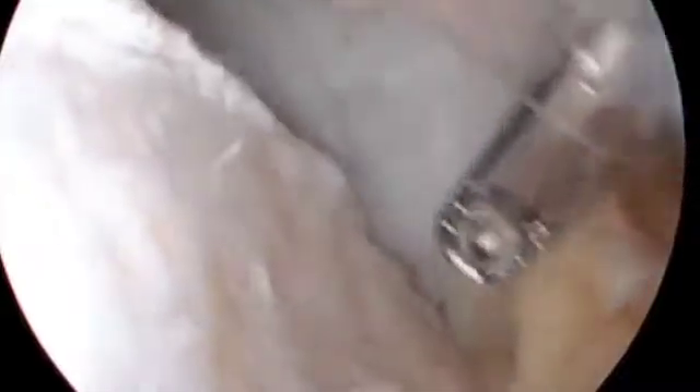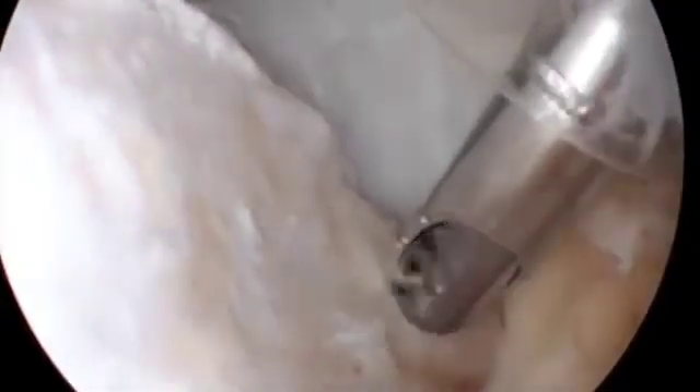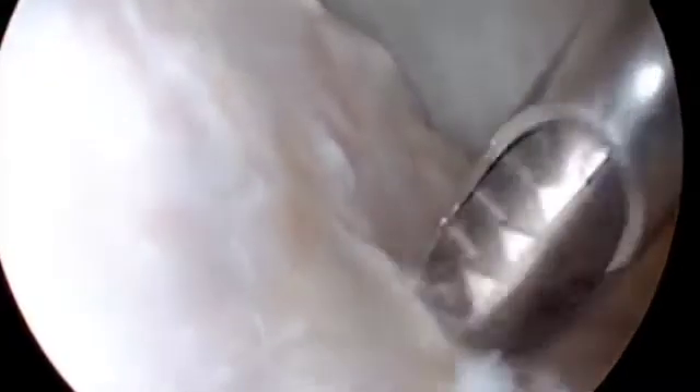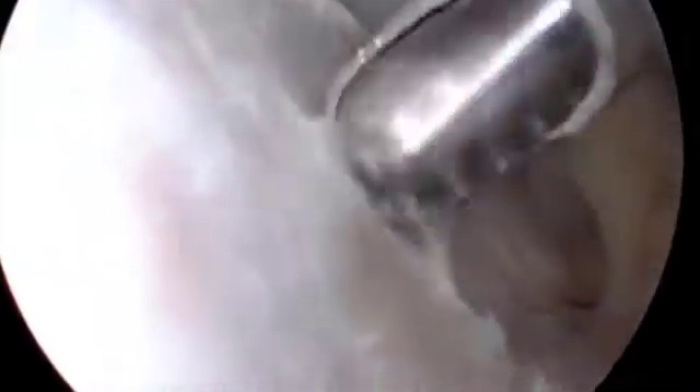An anterior inferior portal is made, which will be the primary working portal for the anterior labral repair. Using a spinal needle, an anterior superior portal is created using an outside-in technique. This portal will allow for suture management during the anterior labral repair and visualization of the Hill-Sachs lesion during the remplissage.